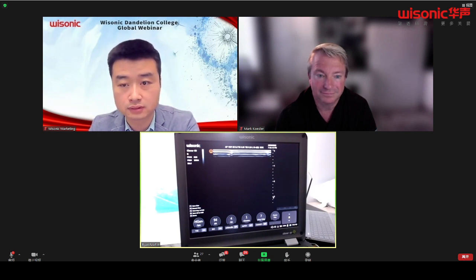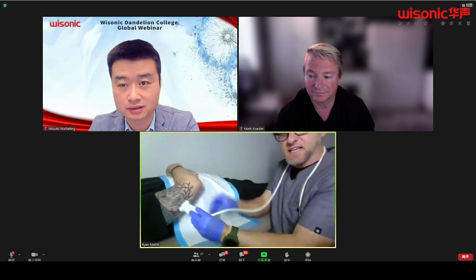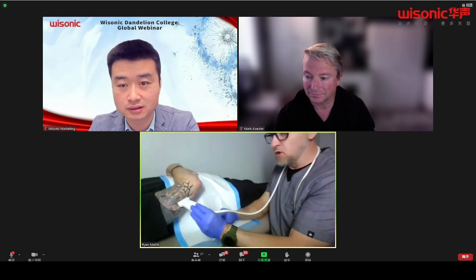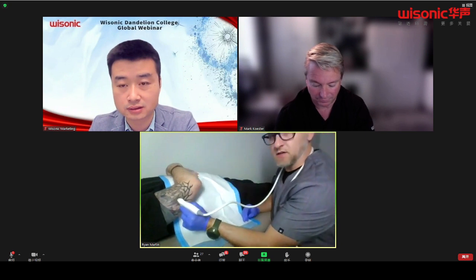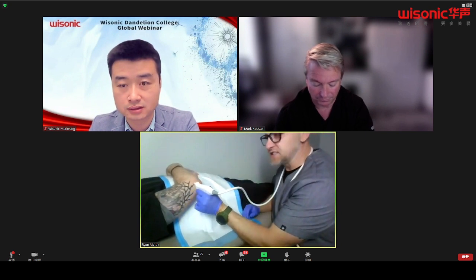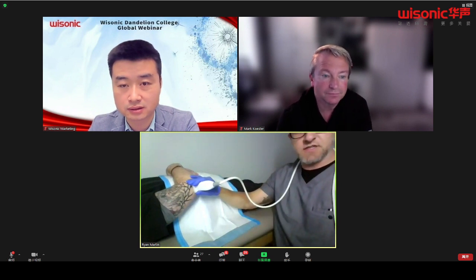Okay, now while we're here, we might as well just do a quick short axis view. And again, what it's going to look like is just taking your probe 90 degrees, so long axis, short axis, and we're going to scan that. And I'll do it with this hand so you can see better. I'm going to scan that from proximal to distal until I see the olecranon. And so let's show you the screen here.